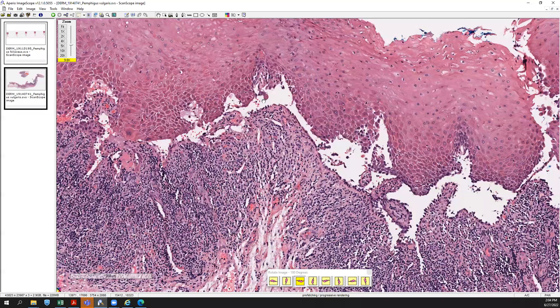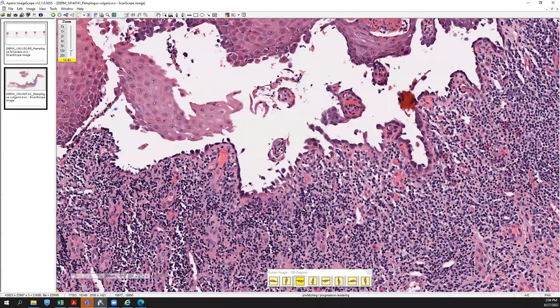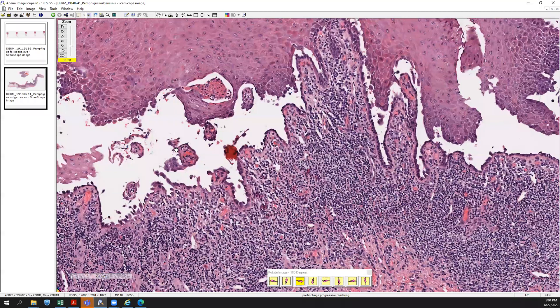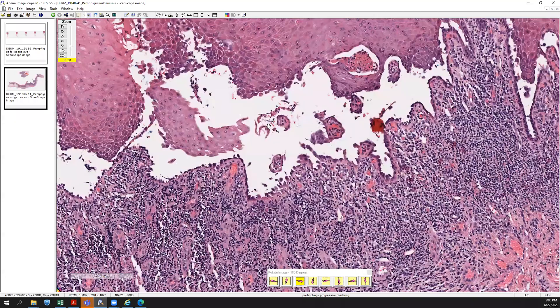Pemphigus vulgaris extends down adnexal structures much more commonly than Hailey-Hailey — that's not impossible in Hailey-Hailey, but it's a helpful hint. If you find adnexal extension in your acantholysis, think pemphigus vulgaris. We discussed the autoantibody, and again on direct immunofluorescence you would find mostly intraepidermal signal, but it would be down near the bottom — compared to pemphigus foliaceus where the signal is more superficial.